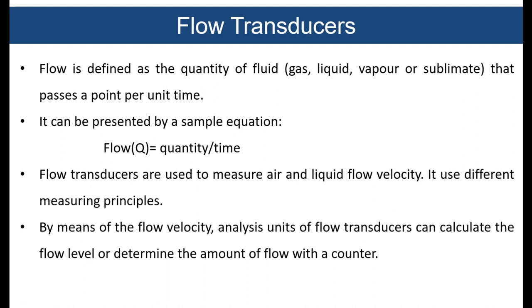By means of the flow velocity analysis, the unit of the flow transducer can calculate the flow level or determine the amount of flow with the counter.